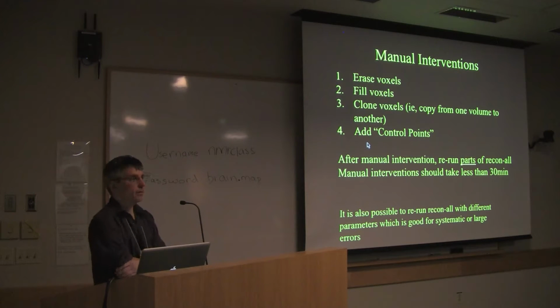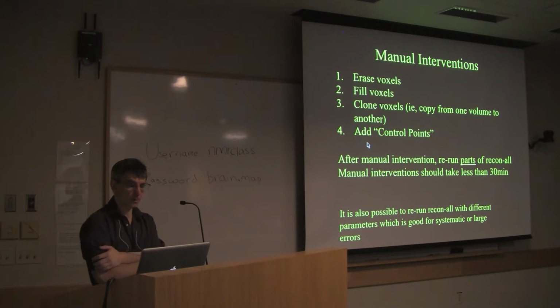And then after you make these manual changes, you would rerun parts of recon all, so you don't have to go in and rerun everything from scratch. So it should only take a couple of hours after you make an edit to a volume to rerun the remaining part of recon all. And it's also possible to change parameters in recon all, but that's a little bit more advanced.